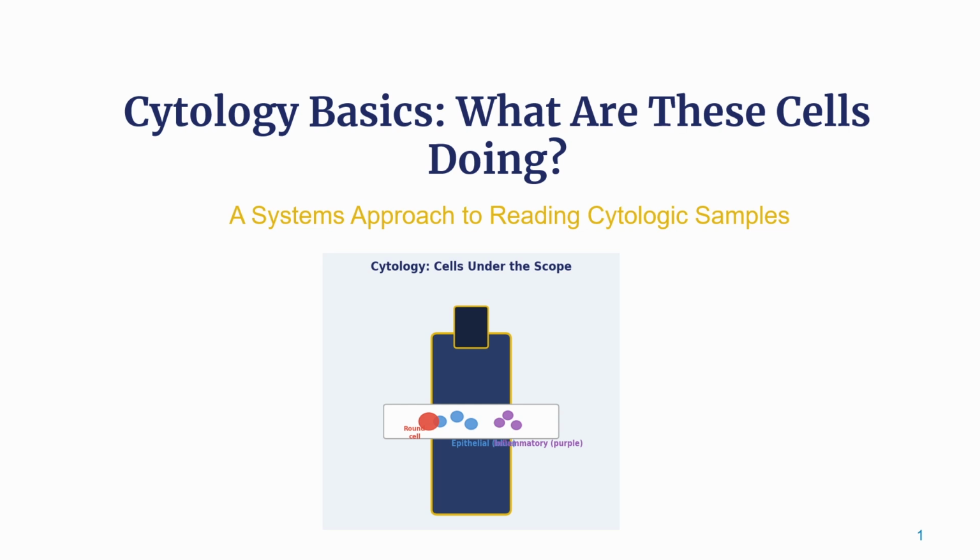Today, we're going to take a systems approach. Instead of memorizing cell names, we'll think about what categories of cells show up, what they tell us, and how to communicate what we see to a clinical pathologist.